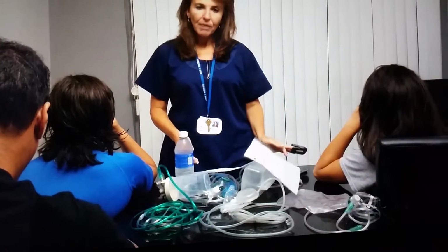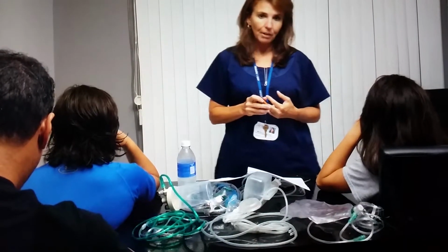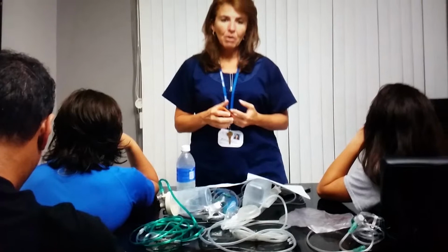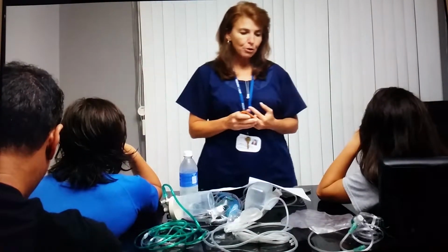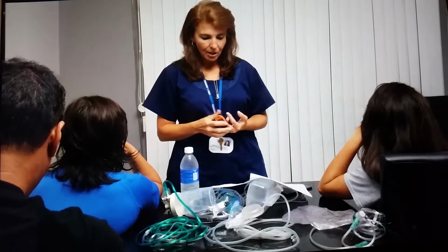As far as critical value reporting, less than 89% in an adult we would call medical response, and less than 93% in a child. We usually titrate and keep patients on oxygen and like their saturations to be above 92%, and for the pediatric population above 95% prior to titrating.